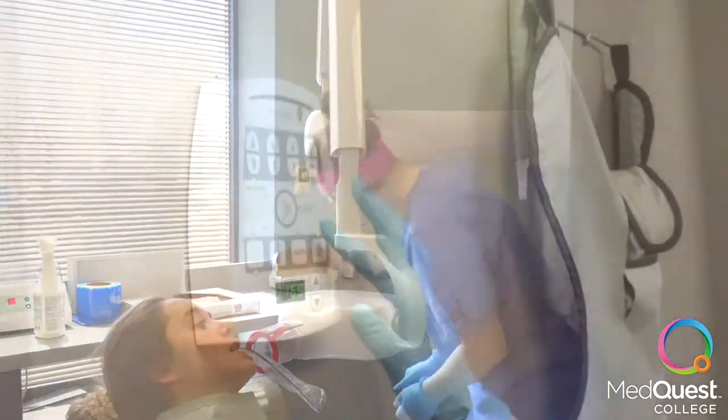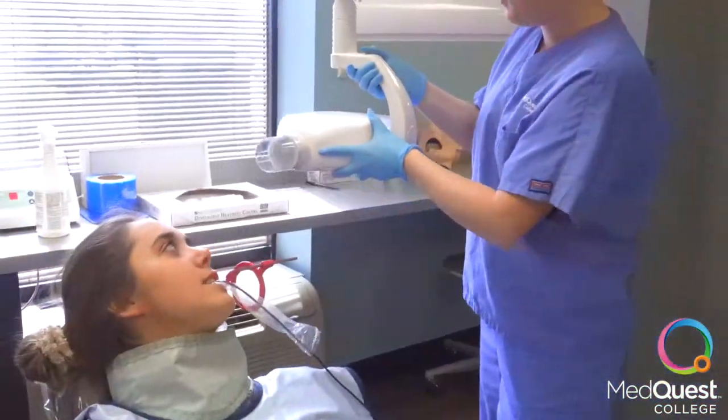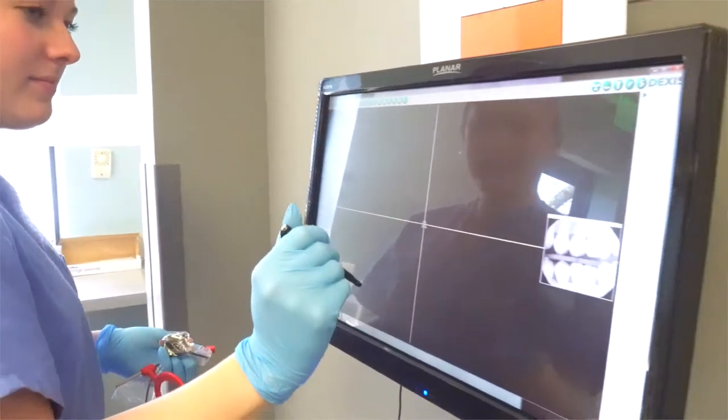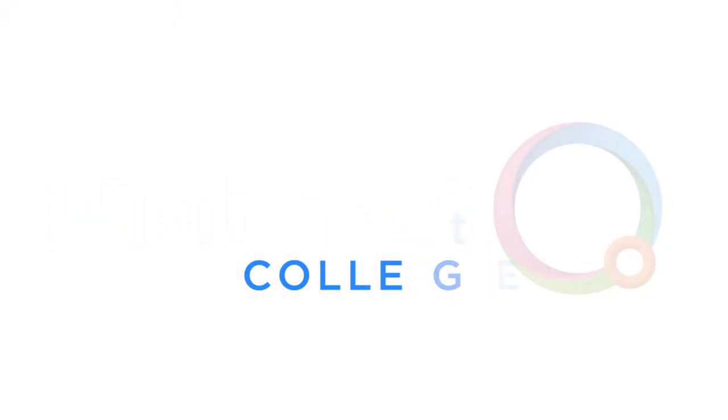Move the tube head to the Wren and walk to the control panel to push the button that releases the x-ray. Take the Wren out of the patient's mouth and make sure the x-ray isn't overlapping, blurry, or dark. If everything is in order, release the patient to the front desk and set the next appointment.